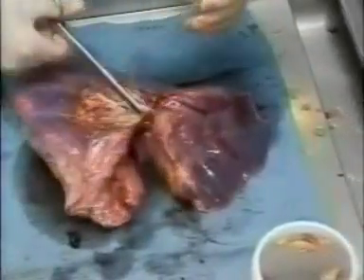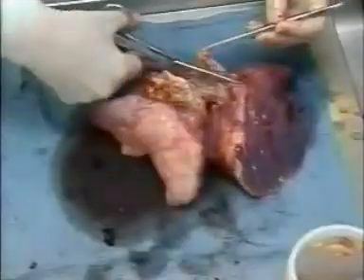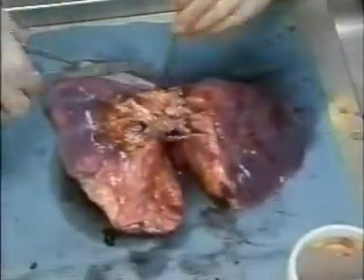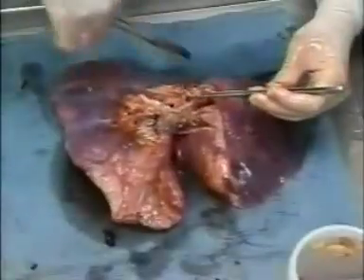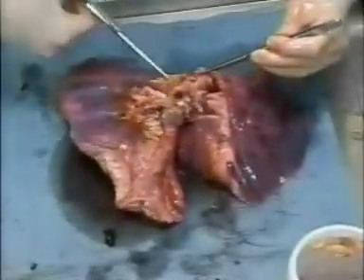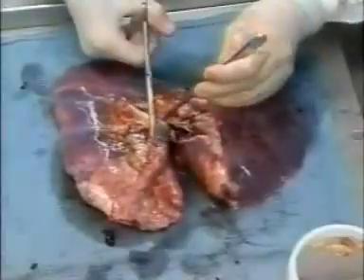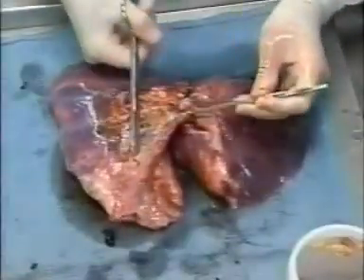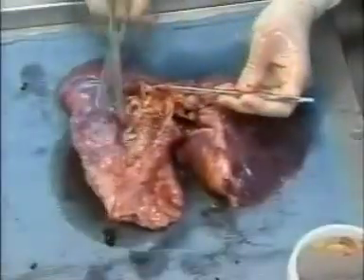Dr. Fricke is now opening the main bronchus of the right lung and following it out through its primary and secondary divisions. Again, the purpose of this is to see if there's any evidence of disease or other abnormalities, such as obstruction by foreign bodies.